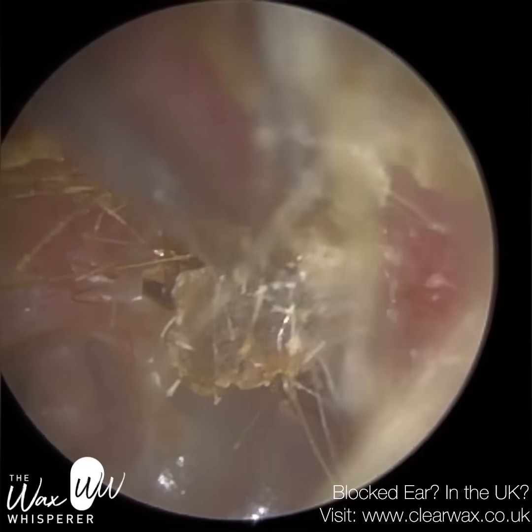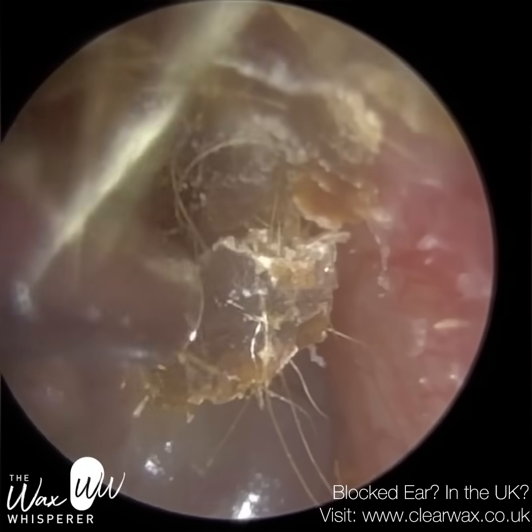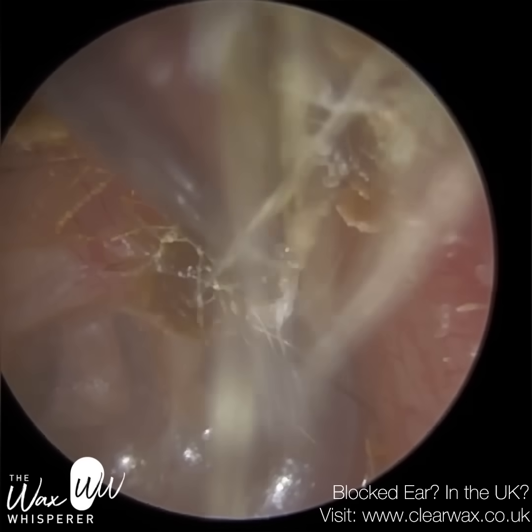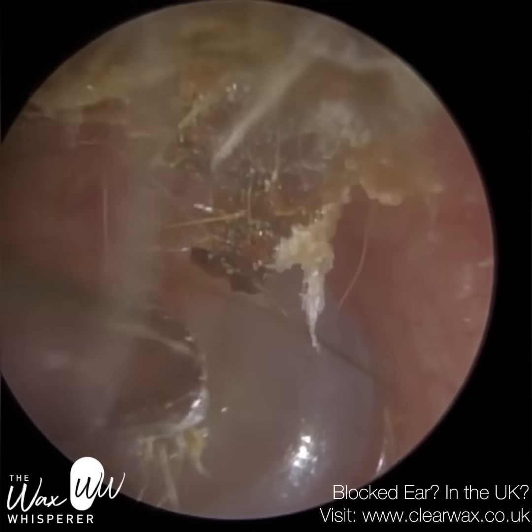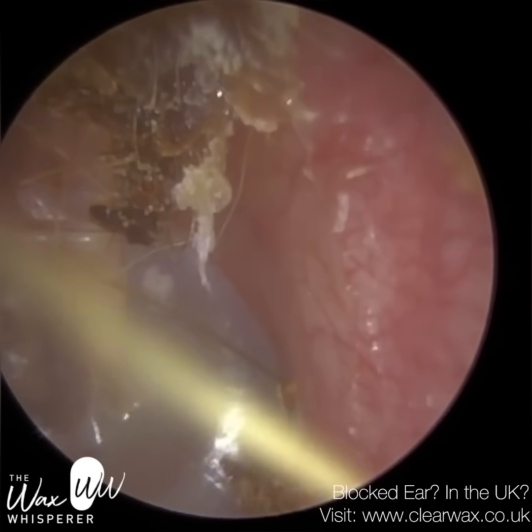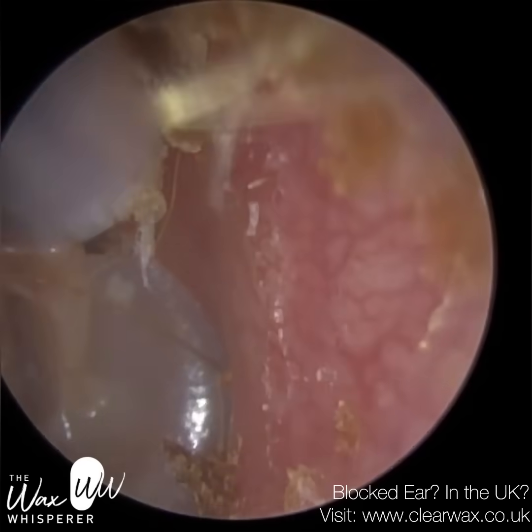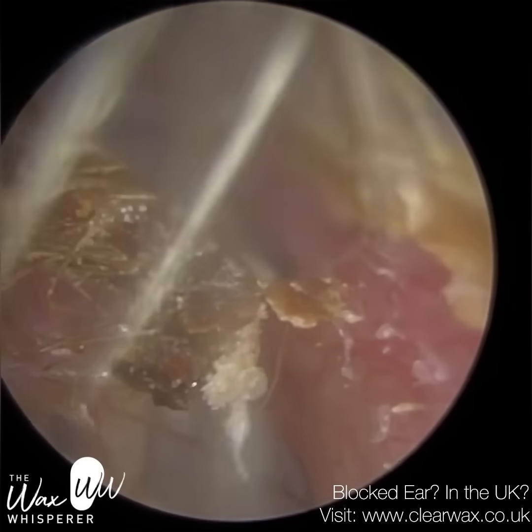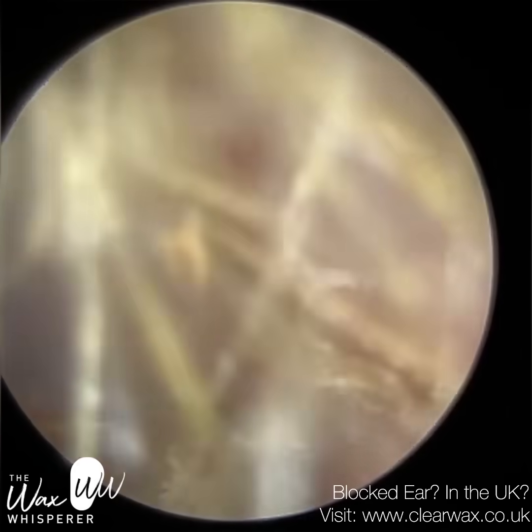Now, the middle ear should be full of air, and the air pressure behind the eardrum should be equivalent to the air pressure in the atmosphere, so in the ear canal. When the air pressure is equal either side of the eardrum, that's when our eardrum is most mobile, that's when we hear the best, that's when the eardrum vibrates most in response to sound waves that are hitting it.